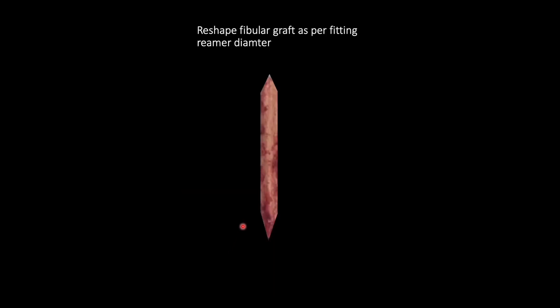If your fibular graft is oversized — meaning the best fitting reamer is smaller than the fibular strut diameter — keep in mind that the fibular strut is not a circular graft; it has a triangular cross section. So you have to reshape the fibular strut according to the diameter of the reamer. The widest part of the fibular strut should be less than the reamer size. You can use a bone nibbler, bone cutter, or even a saw to shape it, and for the terminal parts you have to make them tapered so that insertion is easier.